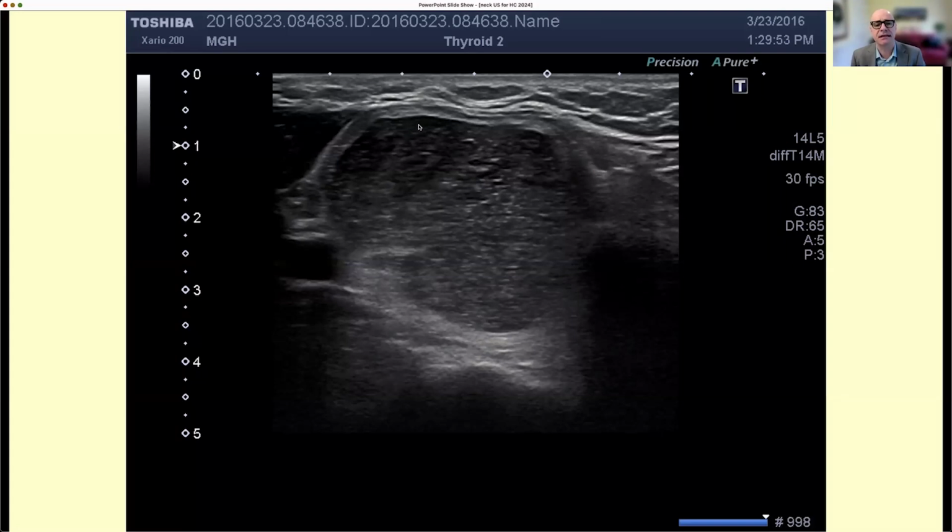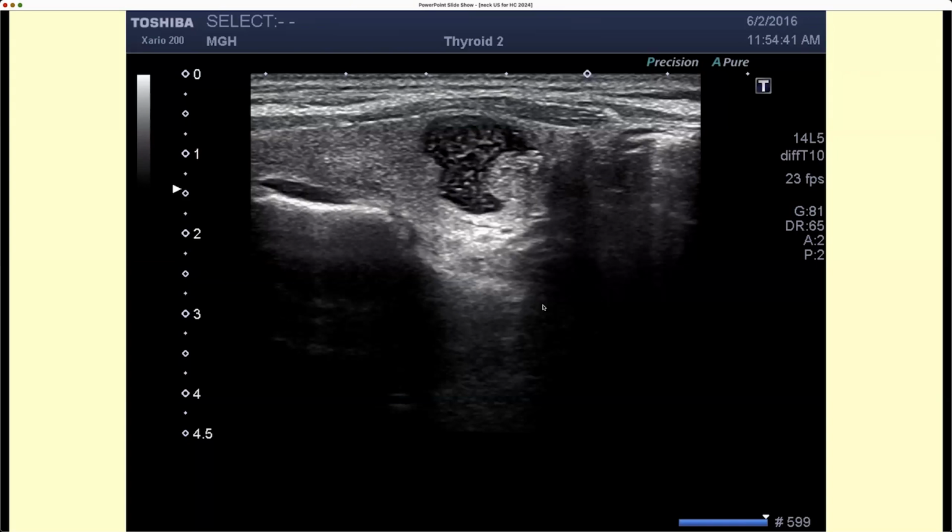So you can see here, to me, it's a hypoechoic nodule that may be solid, but maybe there are microcystic components here, and I don't see calcification, but it's very sizable. Because it's a little unclear, I would certainly consider doing a biopsy. I don't remember the biopsy results of these nodules. I put them here to simulate what happens in the office. You don't know what they are, so I'm judgment-free putting these nodules here so that you can see them and decide what to do about them.